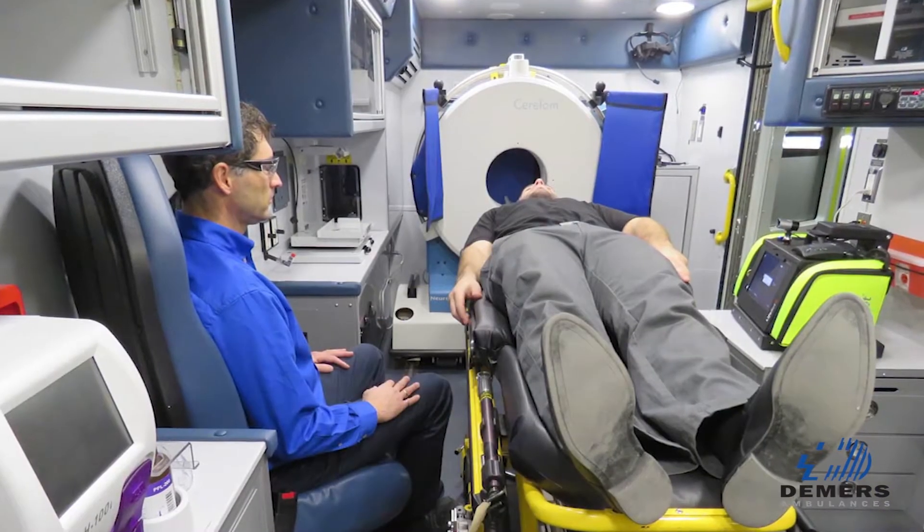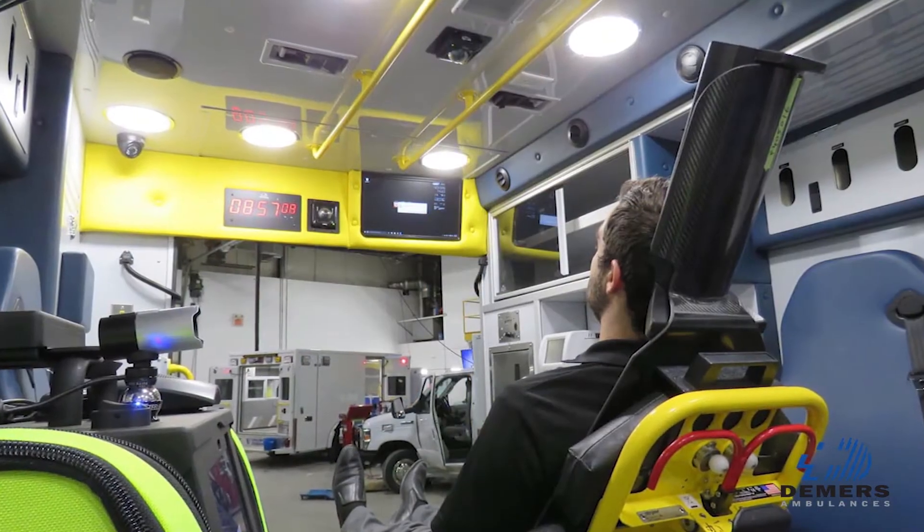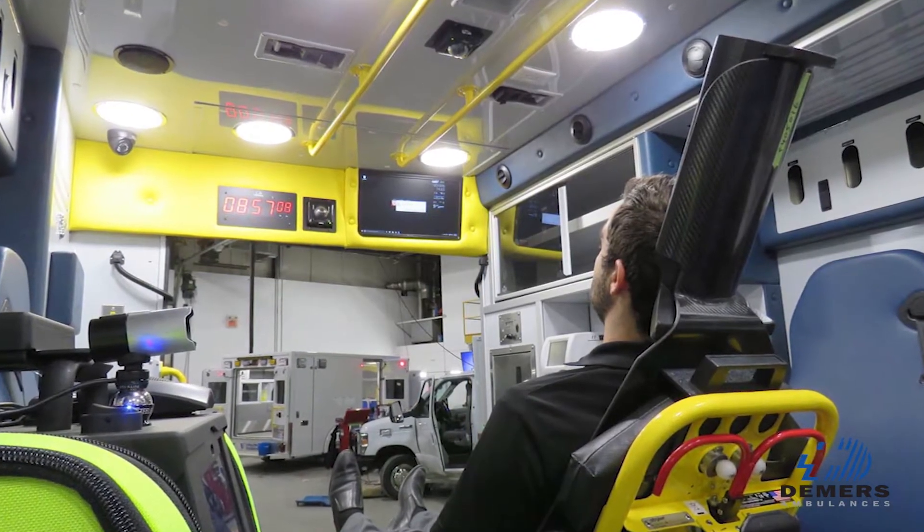The patient who's lying on the cot can actually see and communicate with the doctors who are located remotely in a hospital.